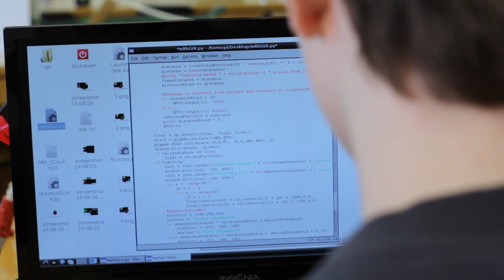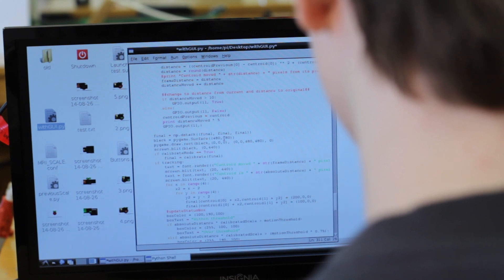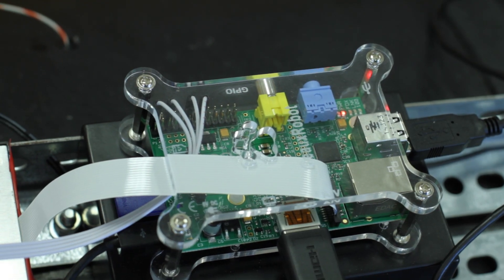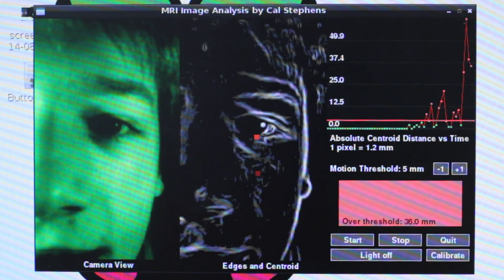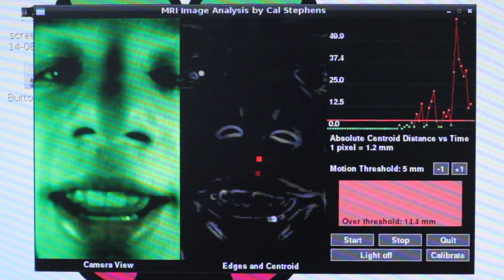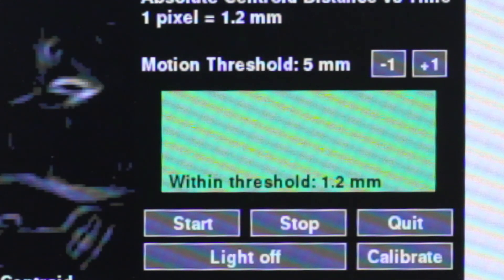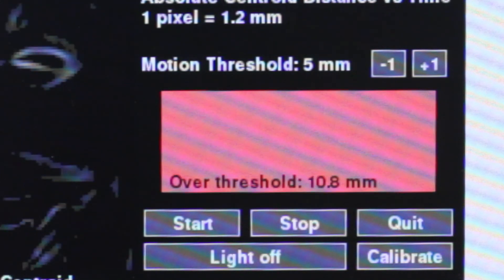After Dr. Hoggart approached me and asked me to take on this project I set out to do exactly that. Written in Python, the application takes images from the Raspberry Pi camera and analyzes those using an edge detection algorithm and then a method called centroid tracking to track the patient's head as it moves around the frame. Using that with the calibrated scale in terms of pixels per millimeter, we can get exactly how many millimeters the patient has moved throughout the trial.